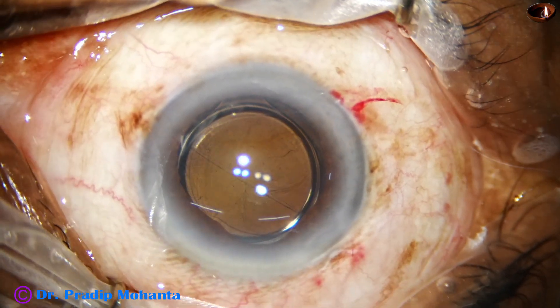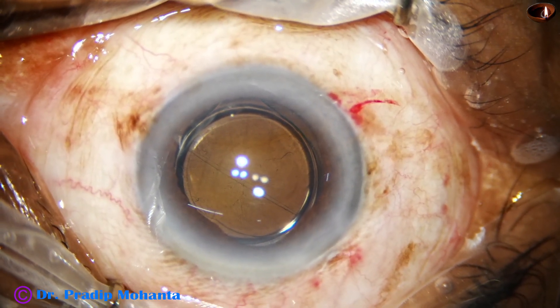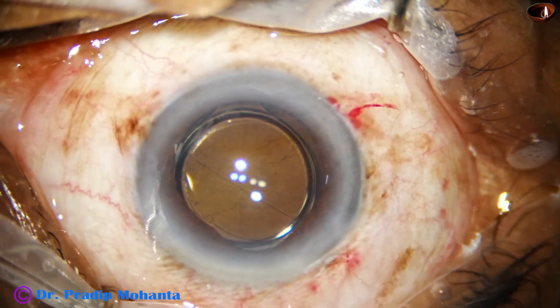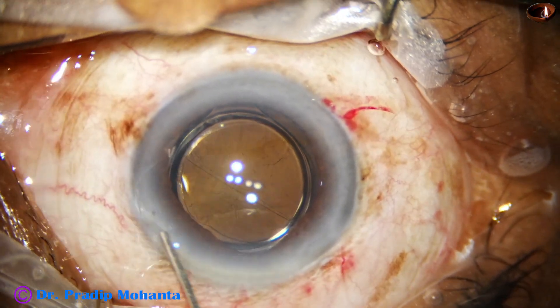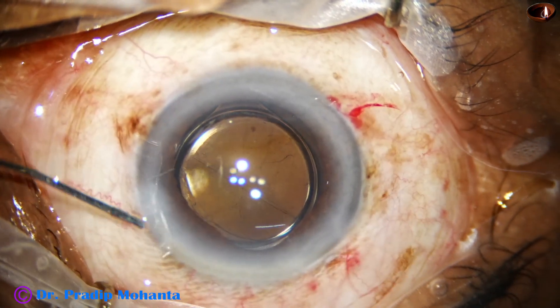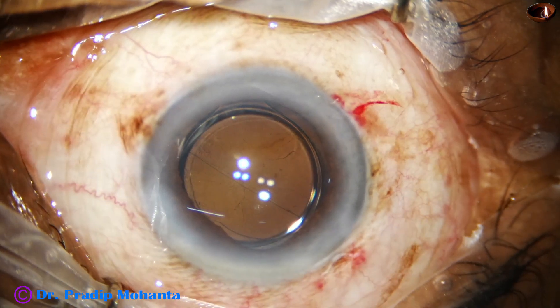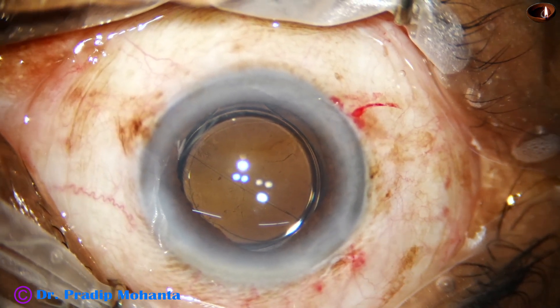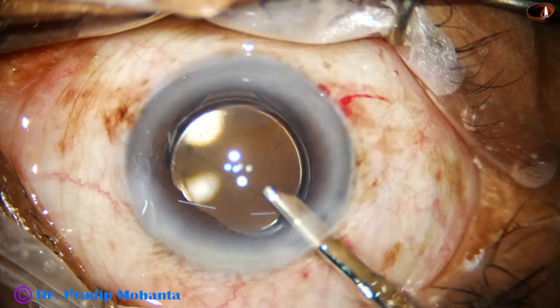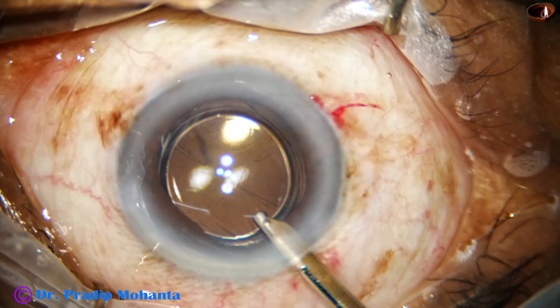This is moxifloxacin. Now the side port is closed by corneal stromal hydration and now it's the time to do the final lavage of the anterior chamber. The final lavage is done.